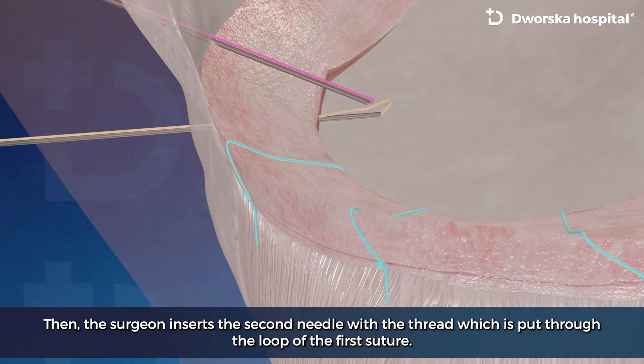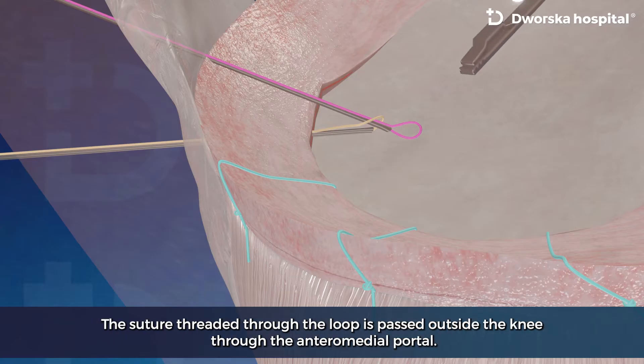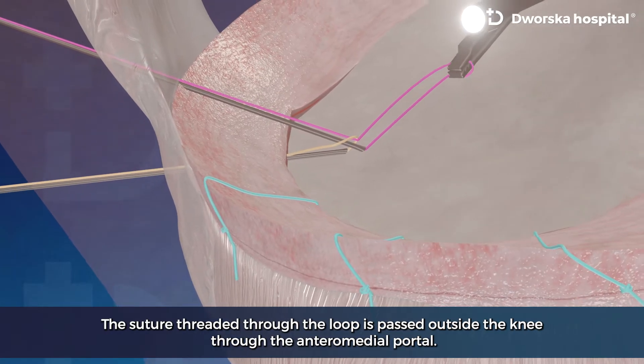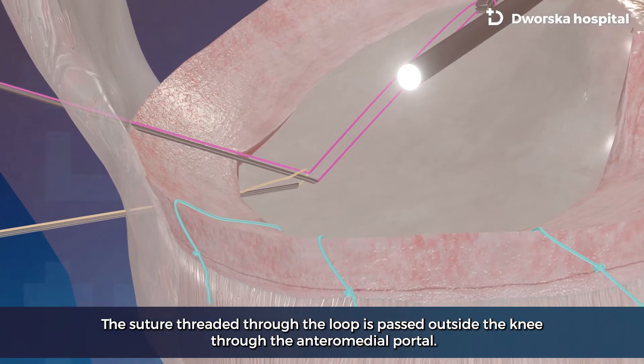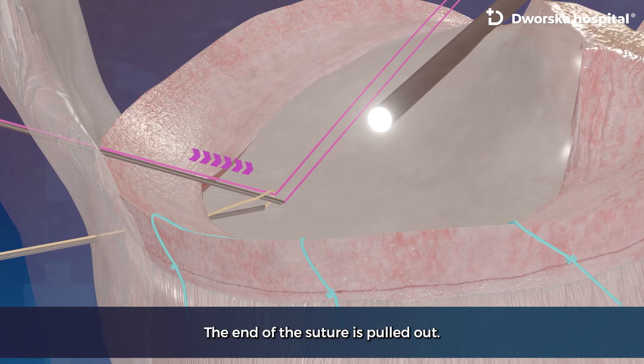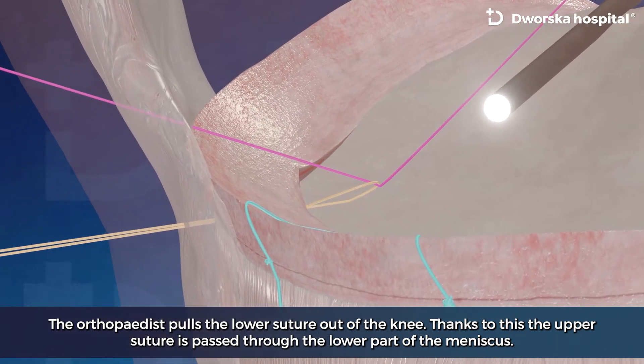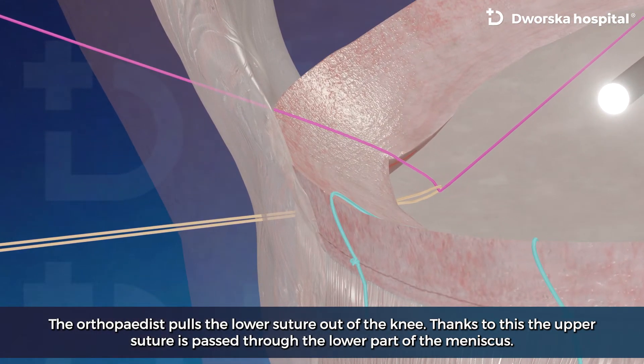Then the surgeon inserts the second needle with the thread, which is put through the loop of the first suture. The suture threaded through the loop is passed outside the knee through the anteromedial portal. The end of the suture is pulled out, so that the upper suture is passed through the lower part of the meniscus.